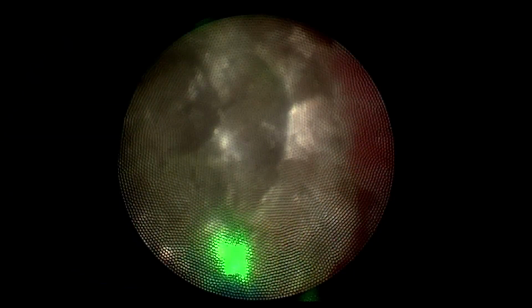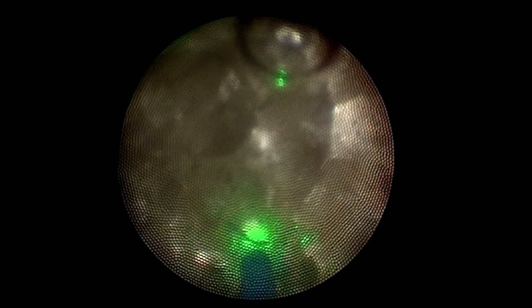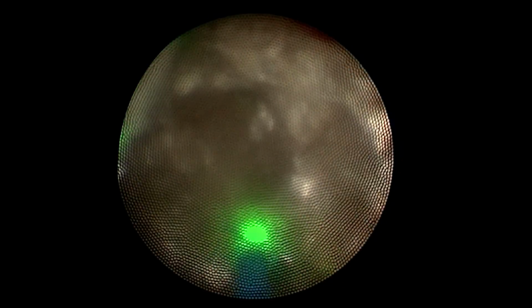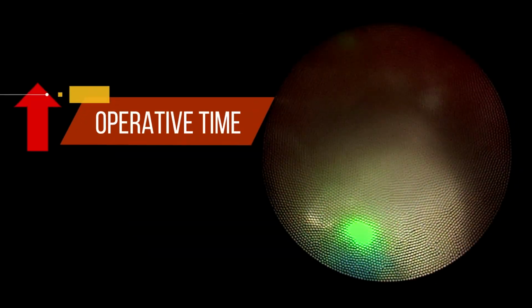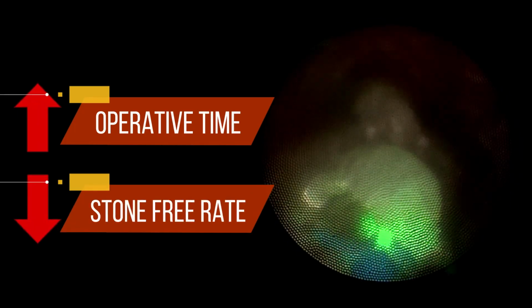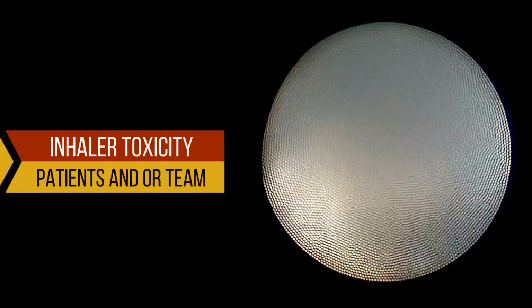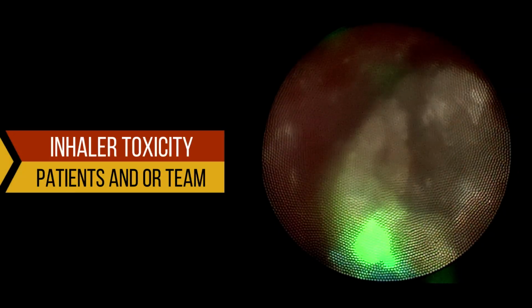The accumulation of hydrogen sulfide-containing hydrophobic gas bubbles during cysteine stone fragmentation may lead to 2 clinical problems. First, hydrophobic clustered bubbles may reduce image quality during PCNL, thereby prolonging operative time and decreasing the stone-free rate. Second, hydrogen sulfide gas carries a risk of inhalation toxicity for patients and healthcare professionals in the operating room.